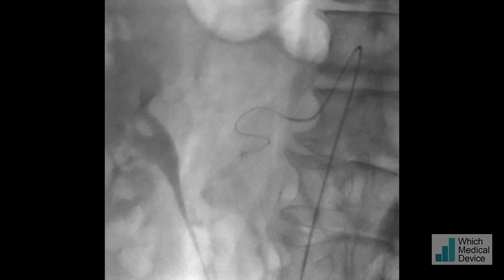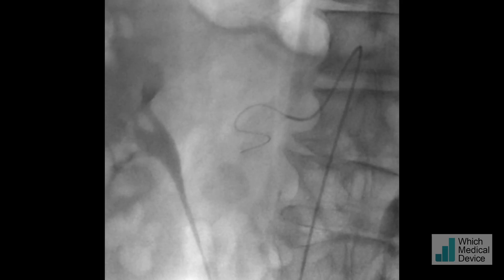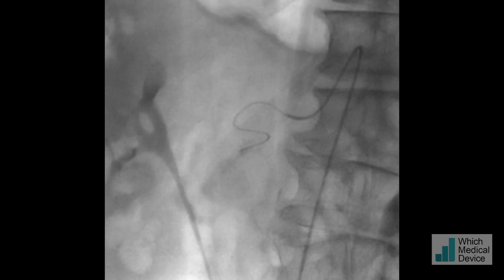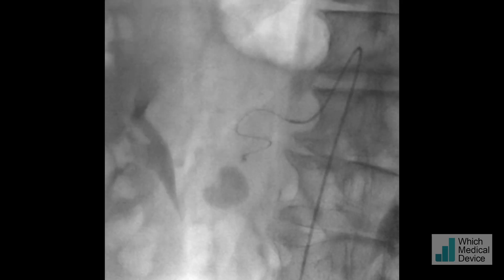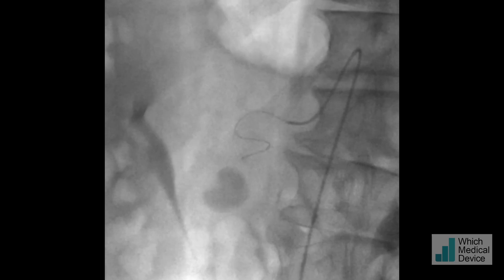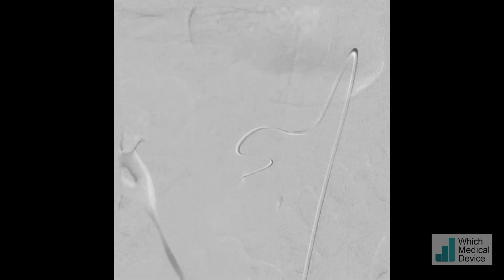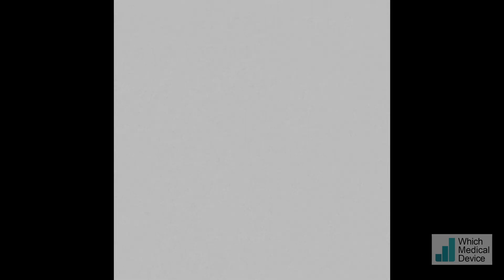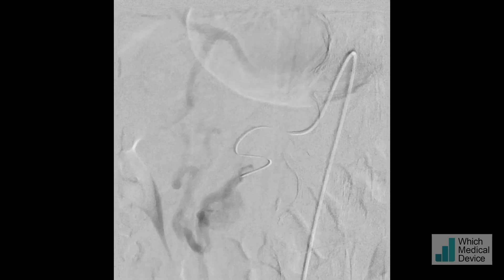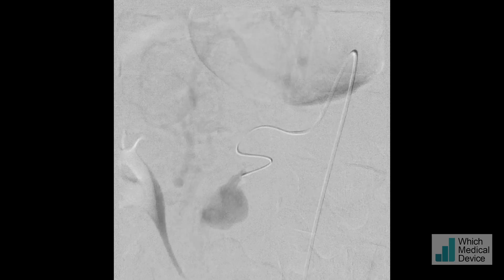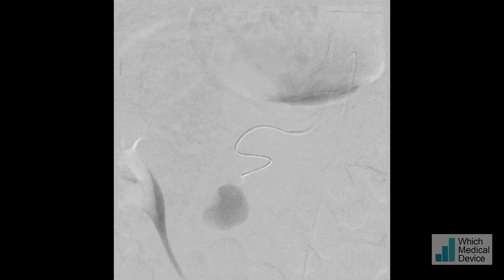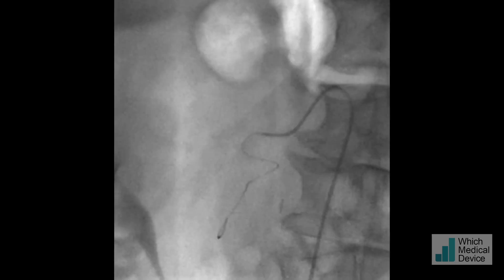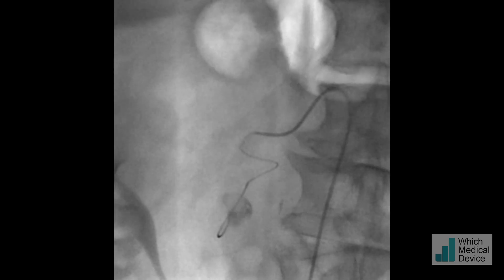I've now got a 2-French Progreat catheter into that vessel, injecting contrast. Again you can see the pseudoaneurysm filling, but it's not entirely clear where it's filling from — it's probably a tiny branch vessel coming off this. You can't occlude this front and back door because of course you'd occlude the flow to the liver.